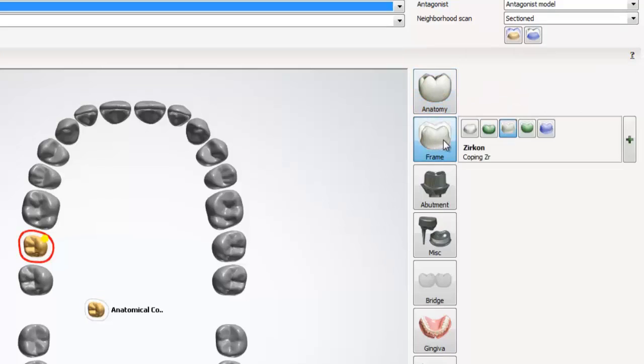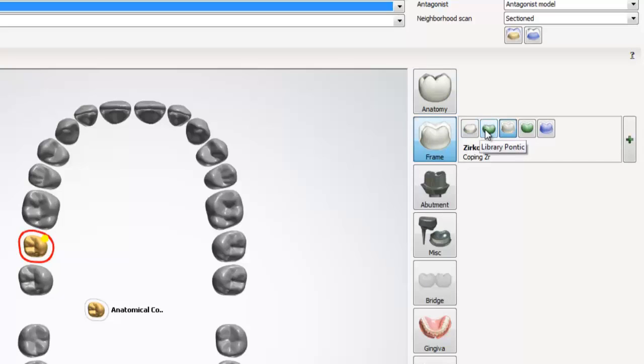The next menu we'll open is the frame menu. Within frame, we can do a simple coping, which is a coping with no buildup. A library pontic, which is a pontic with no buildup.